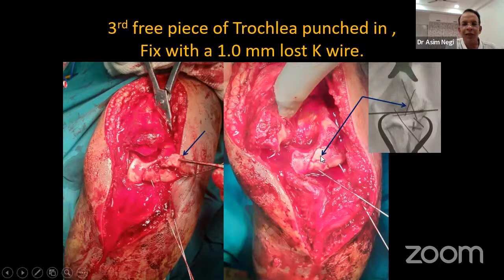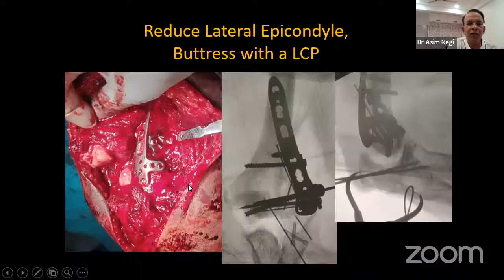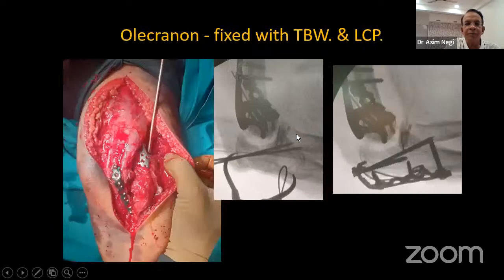Forget about it. You can see the depressed head radius, the annular ligament is seen but not cut, with the joystick there, periosteum there. This piece was elevated and then subsequently fixed with two headless compression screws. So head radius is fixed now. This is the temporary reduction of the distal humerus. And then you reduce the lateral epicondyle, buttress everything with a plate, which we saw just now, the way we do it. And then the olecranon is fixed with a TBW and LCP.